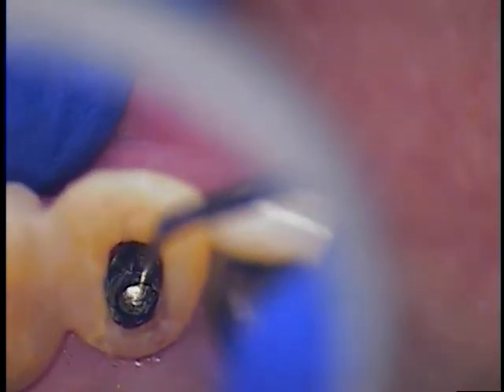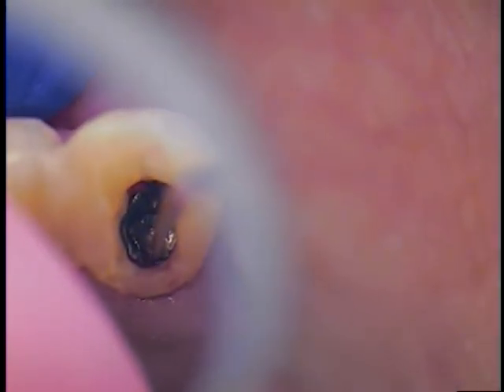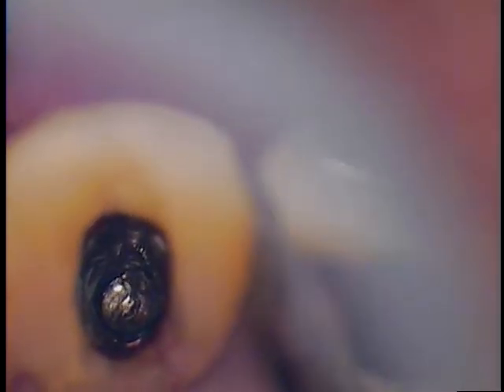You got to have a microscope, I'll tell you that. Without a scope, you feel like you're abandoned. And now we're spinning out the screw. See the head? We just got the screw out. And we're going to do the final cleaning of the threads. Once we do that, we'll be in good shape.